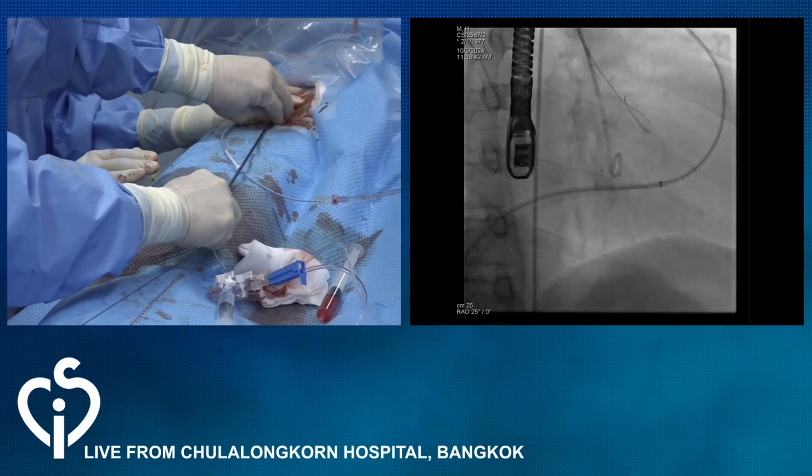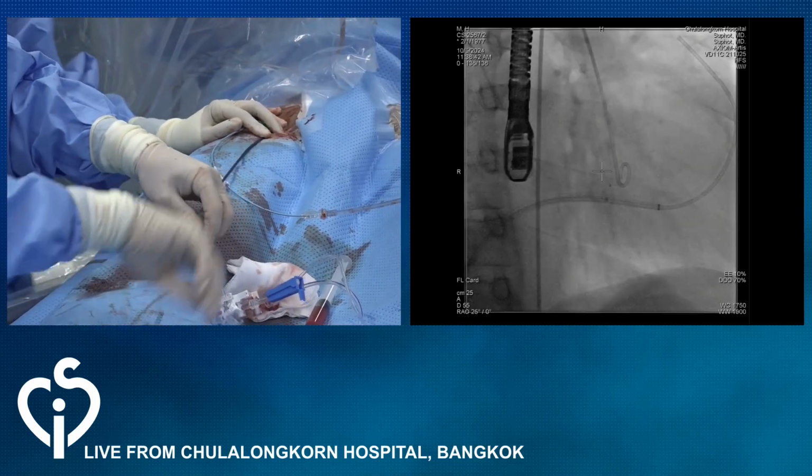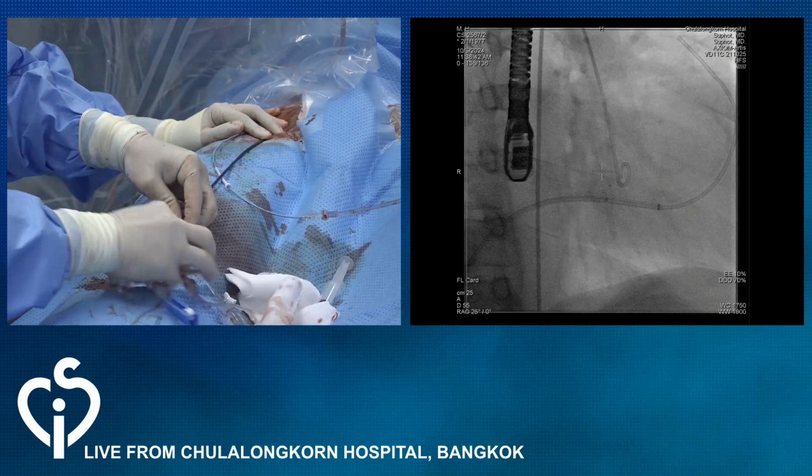Yes. Okay, just show us the trace of the pulmonary artery pressure, and then LVEDP, and then we're done.